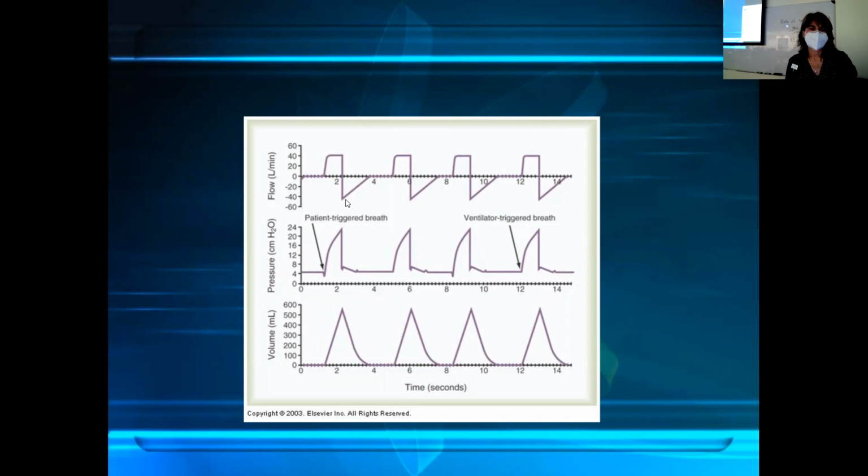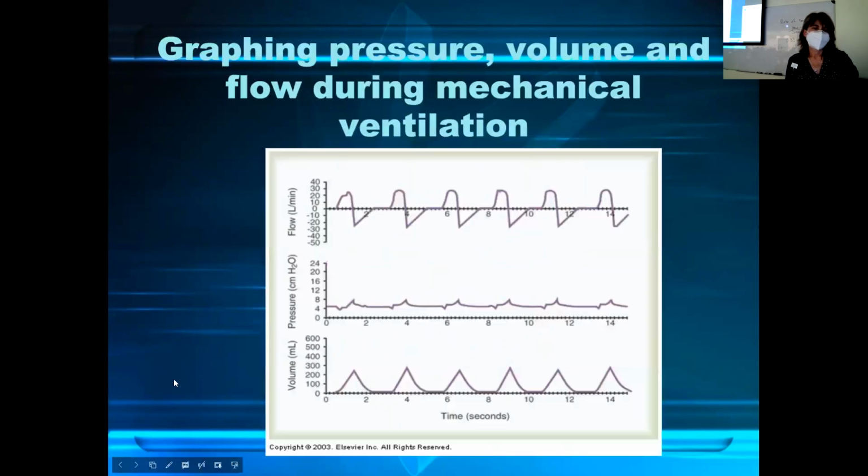That's on the ventilator. Yeah, this one is on the ventilator. The other one has a little bit of slope. Look at this, a spontaneous breath and the one before. It's negligible, but there's a little bit of a slope there. So the expiration would start right about there, right? Yes.